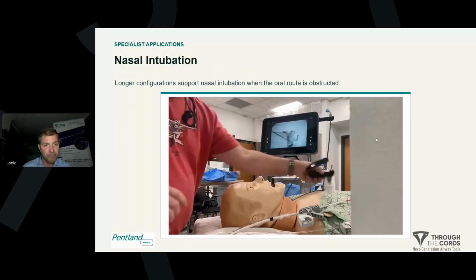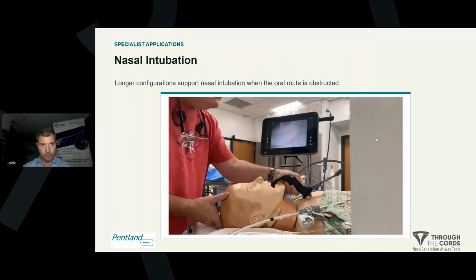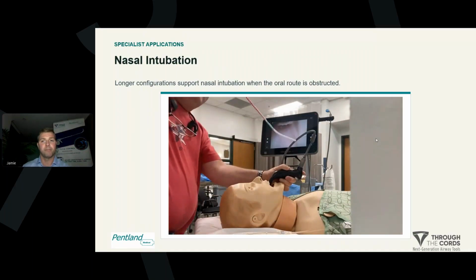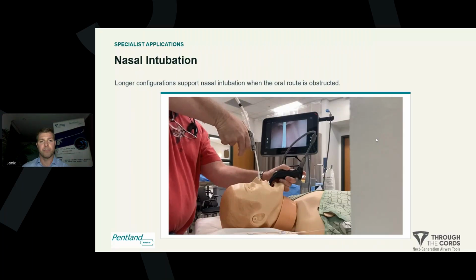It's a demonstration of a nasal intubation with the TCI, or the Runnels steerable introducer. So video laryngoscope into the mouth as normal. Obtain a view of the vocal cords. Articulate the tip, and note that it can articulate up and down. So I'm going to put it in straight, and then as I enter the nasal passage, I'll release it so that it rounds the curvature of the nasal passage and enters the posterior pharynx. So into the nose, release the tip, and that just lets it slip around. It appears in my video laryngoscope view. Put it right at the vocal cords.